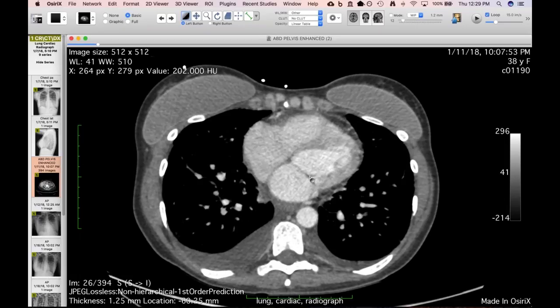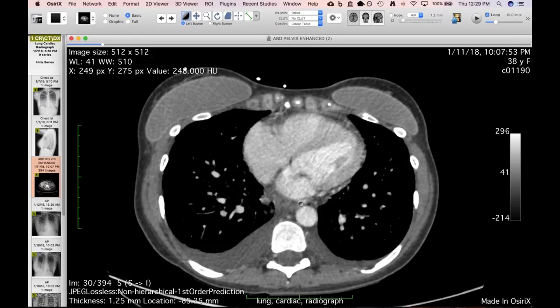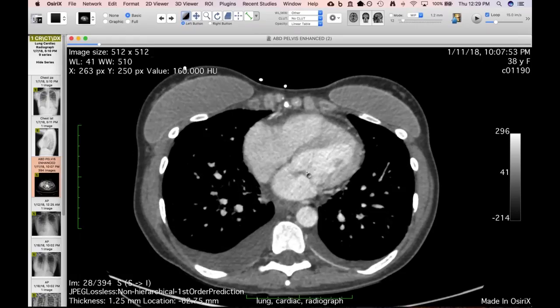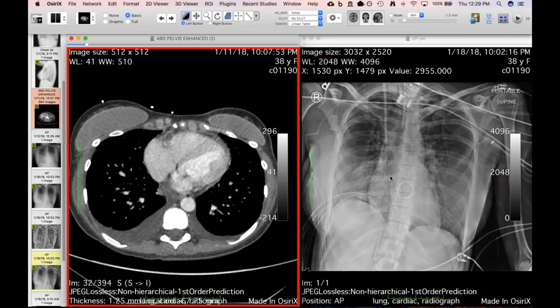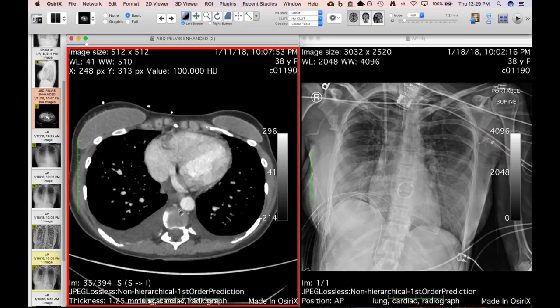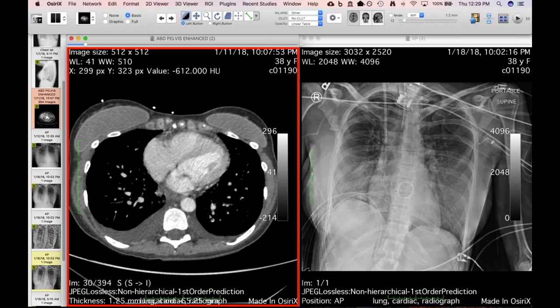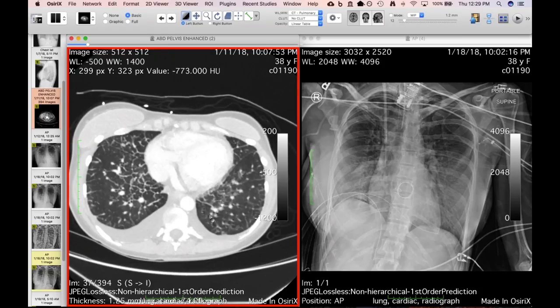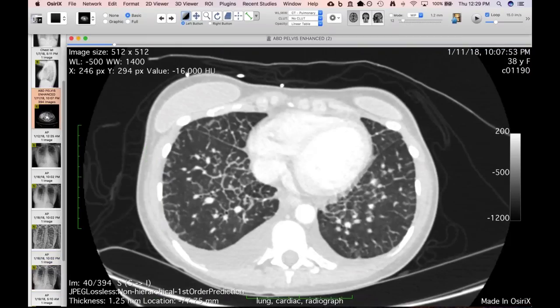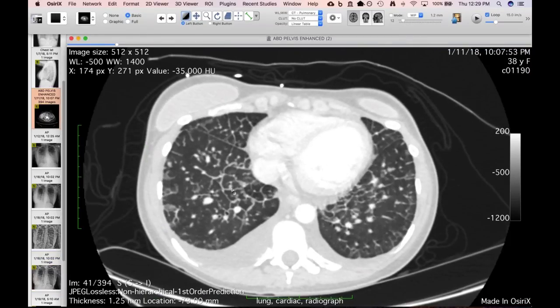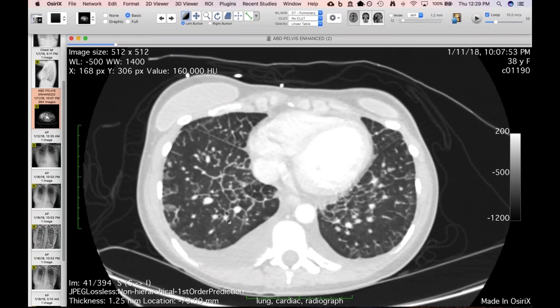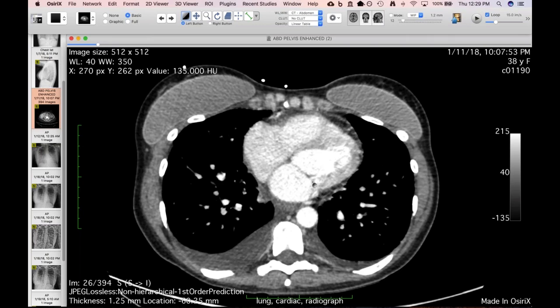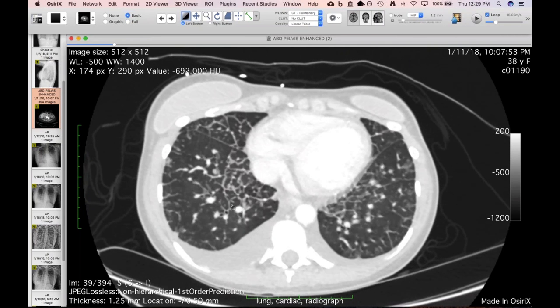A colleague argued it was subtle, but I'd argue if you don't look for it, you're never going to see it. She subsequently underwent mitral valve replacement and her edema improved. The edema appeared slightly more right than left — maybe asymmetric from mitral insufficiency. When I switched to lung windows, I thought this was the best case of Kerley lines I'd seen.